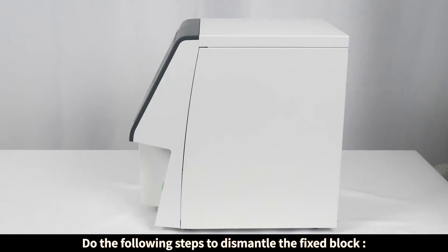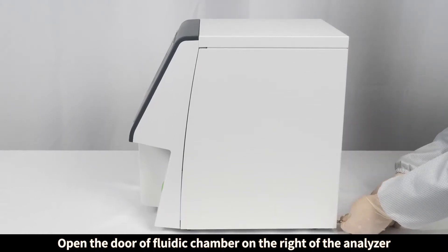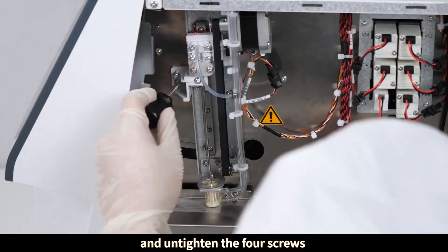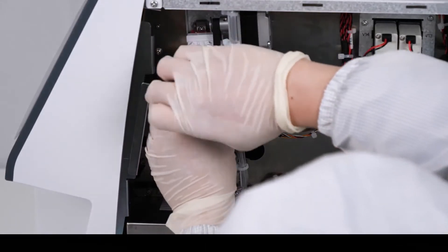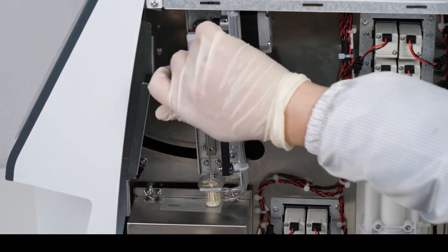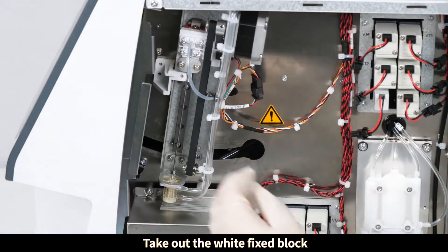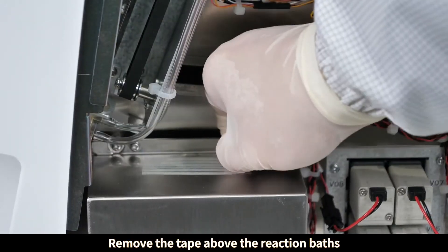Do the following steps to dismantle the fixed block. Open the door of the fluidic chamber on the right of the analyzer and untighten the four screws. Take out the white fixed block, tighten the fixed block again, then remove the tape above the reaction baths.